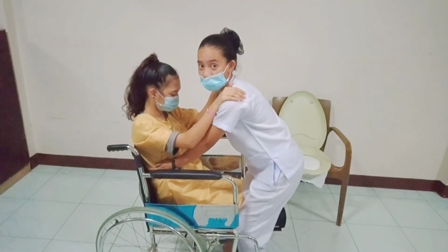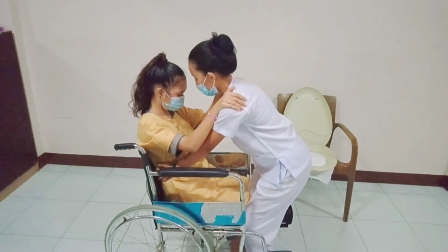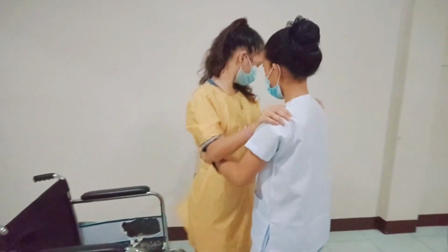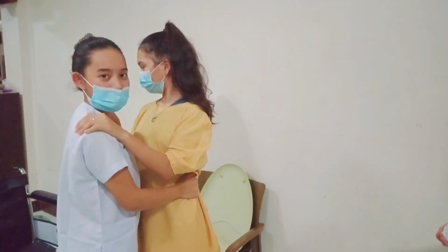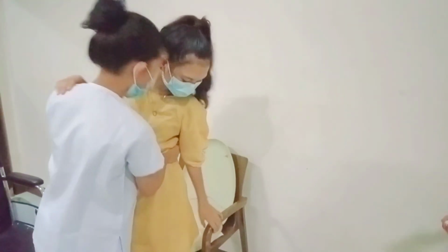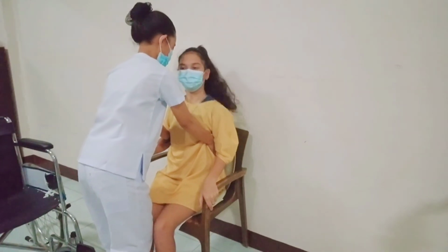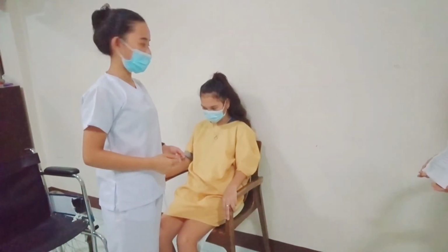Next, straighten your knees, lifting client to a standing position, at a count of 1, 2, 3. 1, 2, 3. And then pivot client to commode. And then place client's hand on armrest and lower client to seat. And be sure client's buttocks are well positioned at back of seat comfortably.